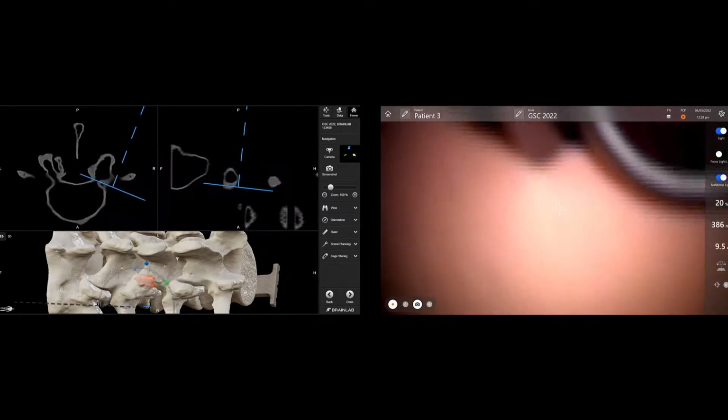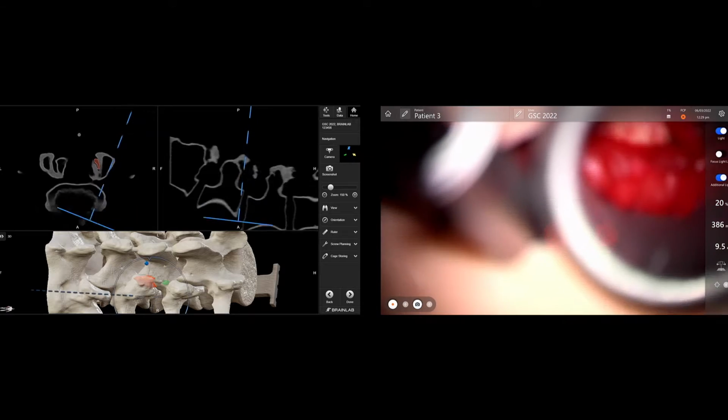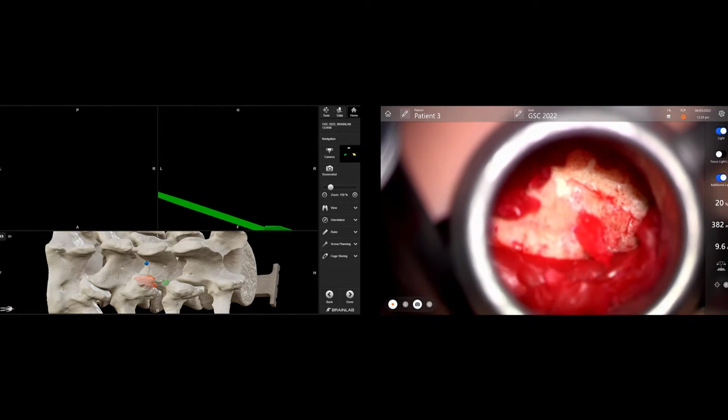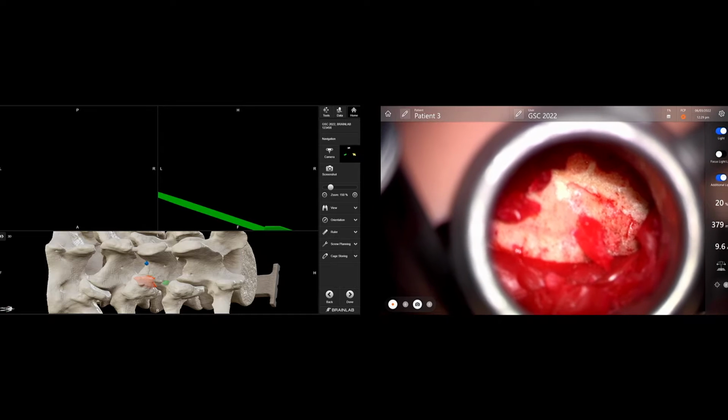Oh yeah, come a little higher. So I would, yeah, that's okay, thank you. So you want to make sure you're really in a comfortable position.